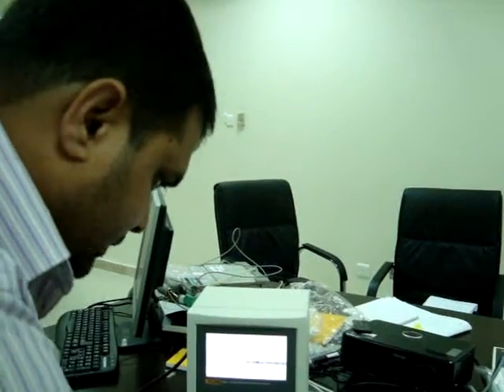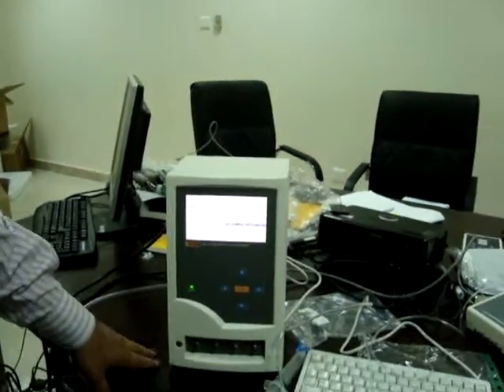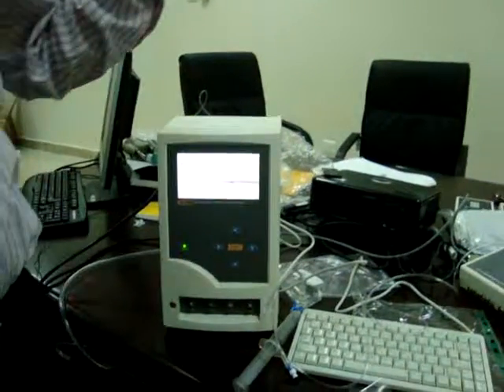So now one thing about the bolus test. If your basal rate is say 2 ml or whatever, your bolus rate should be at least 4 times that minimum. Otherwise it's not called a bolus. So if you are setting a basal rate of say 5 ml per minute and you want to give a bolus of 15 and test, you will get a wrong result.